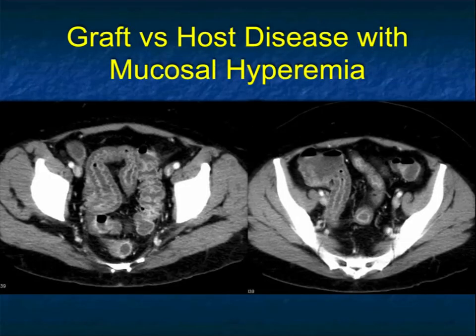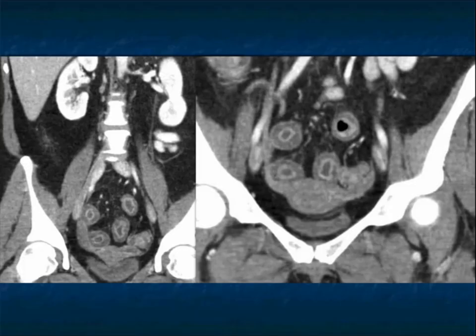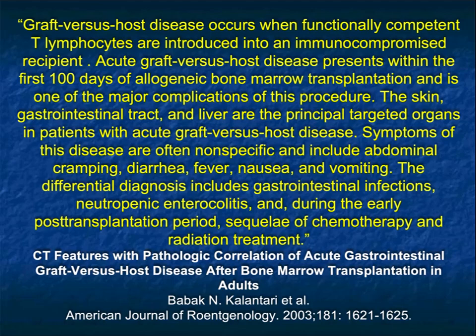Here's another case. Look at the patient's small bowel — markedly thickened, mucosal enhancement, submucosal edema, mainly involving the ileum. But you can also see that the sigmoid colon, rectum, and perhaps the cecum are involved. Here are a couple more images showing a very similar picture to the last case — graft-versus-host disease. Let me just remind you of a few things.